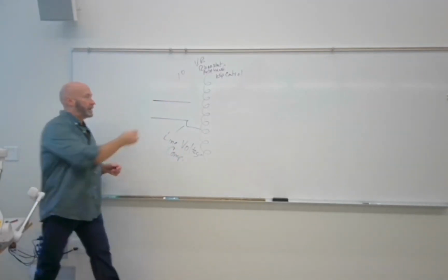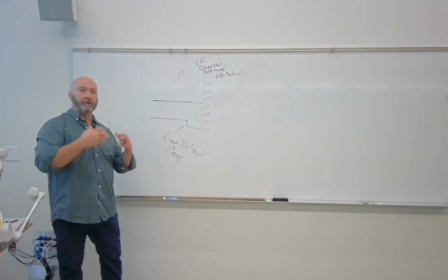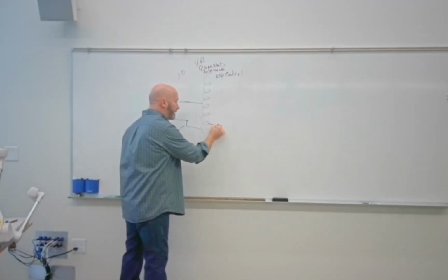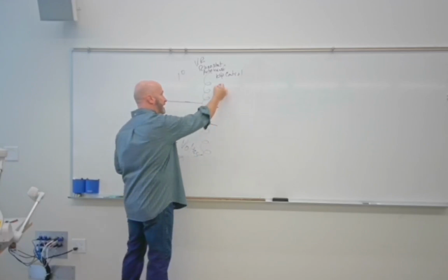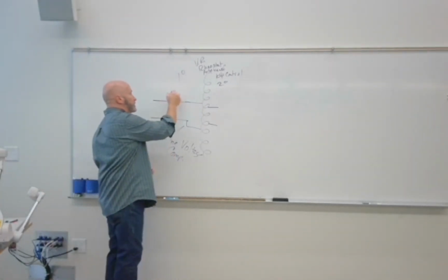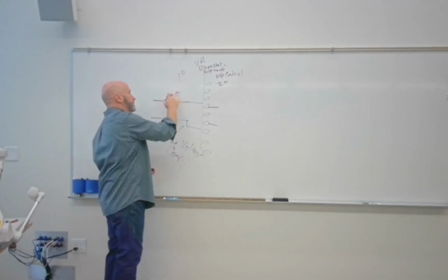It works off of the incoming line voltage and alternating current to create a changing magnetic field. So if we tap in somewhere with fewer coils on the secondary side than on the primary side, then our voltage goes down, right? So if we feed it 220 volts, 240 volts, whatever, let's just make it easy and say 200 volts.